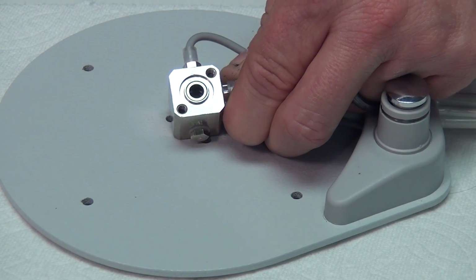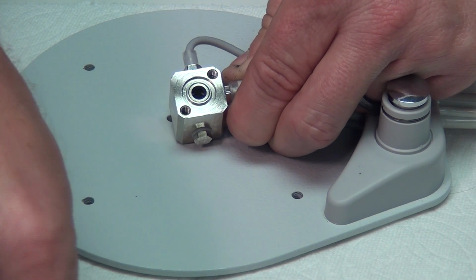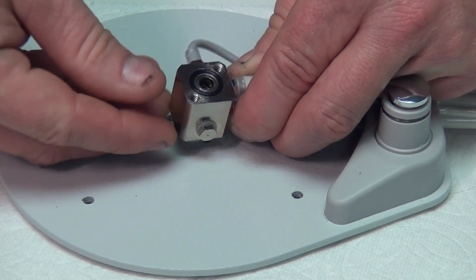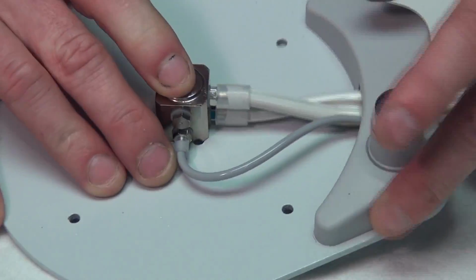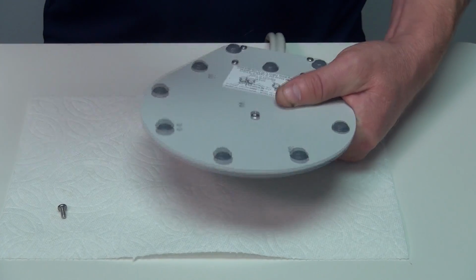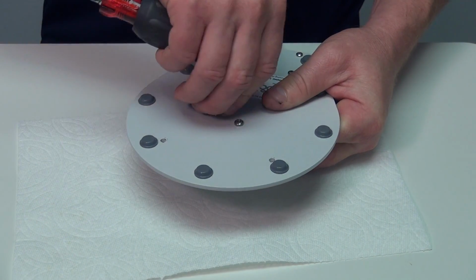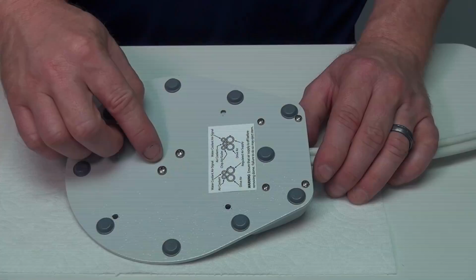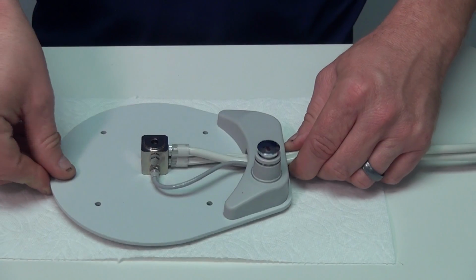Once the barrels and the 2 small O-rings have been inserted, take the large black O-ring, place it on the bottom of the housing. Flip the foot control plate upside down, place the 2 small Phillips screws back in through the bottom, and secure. Once we tighten down the 2 small screws back to the pedal, flip it upright.